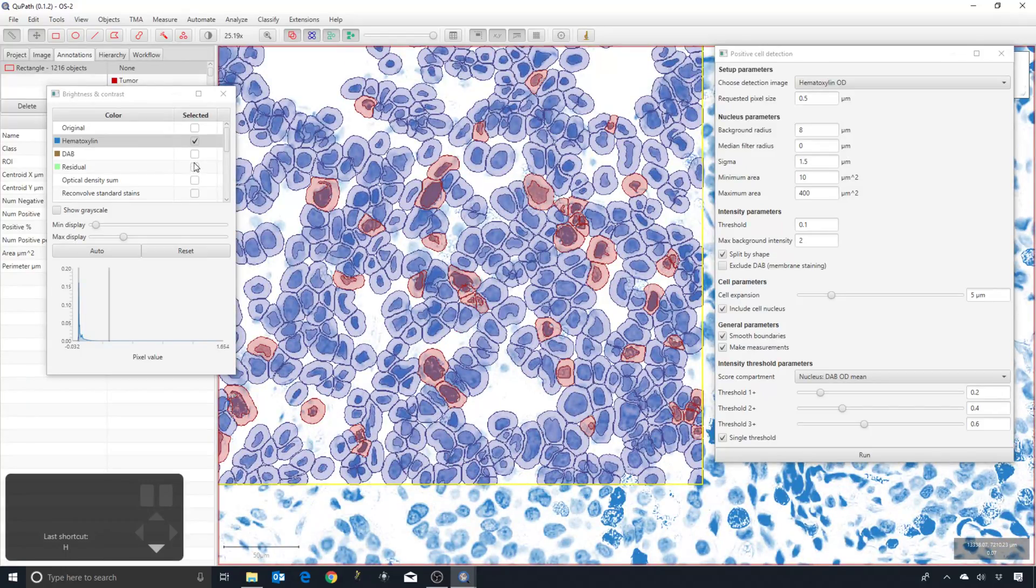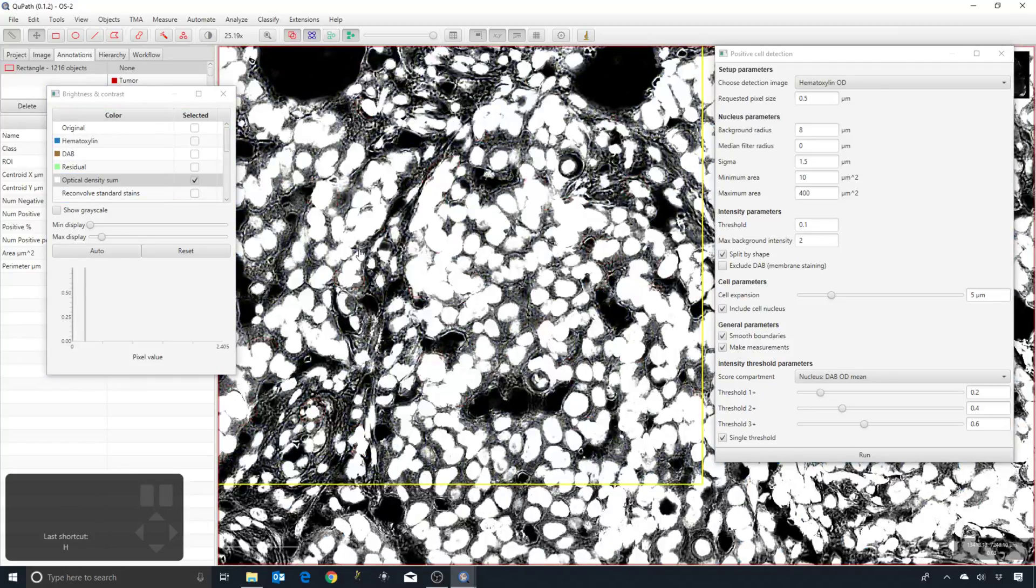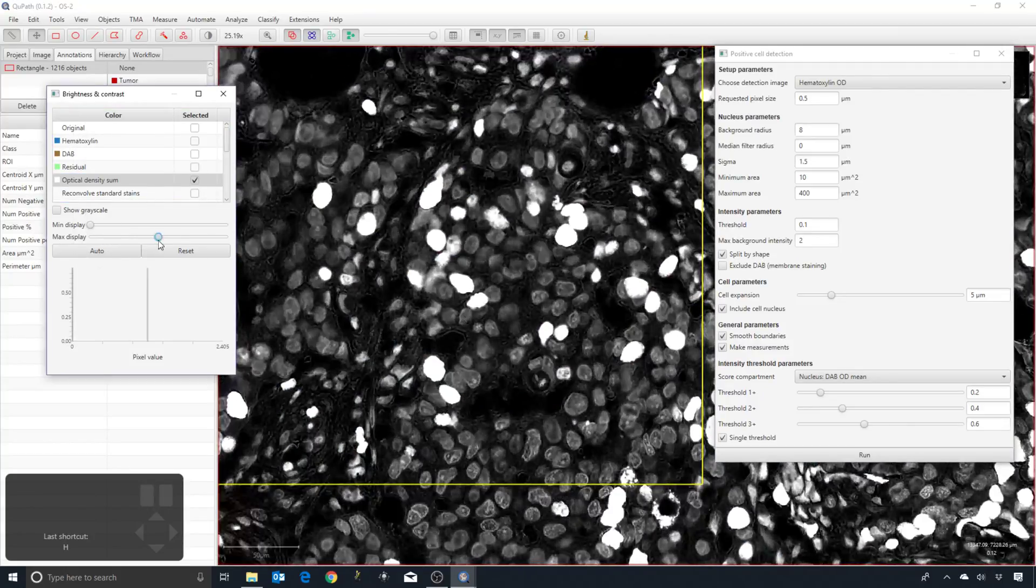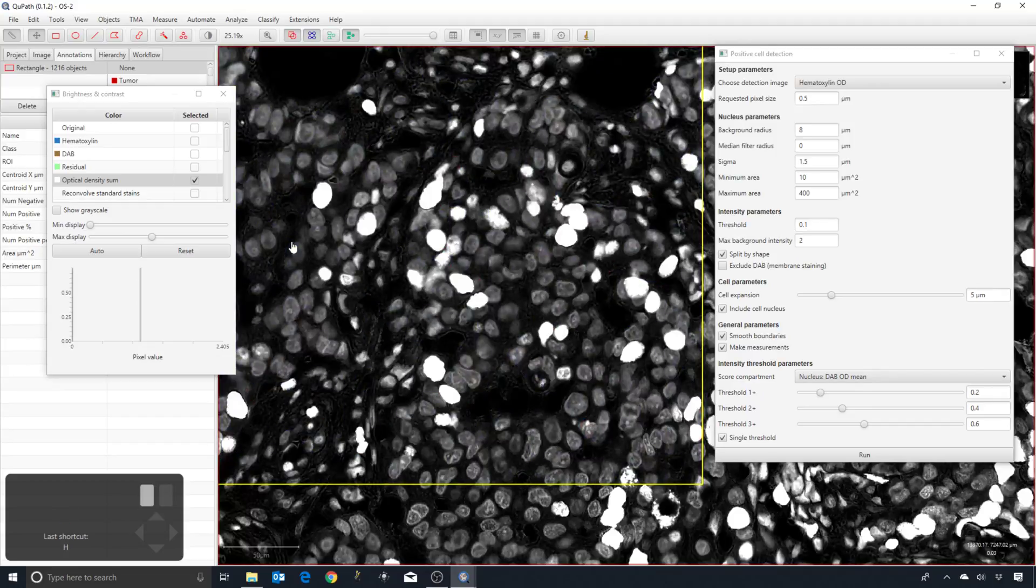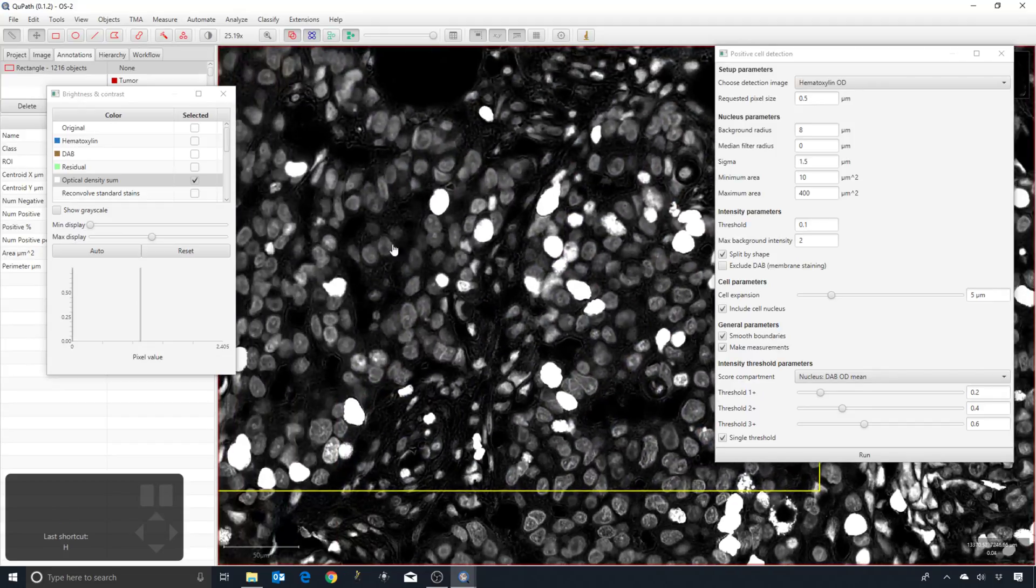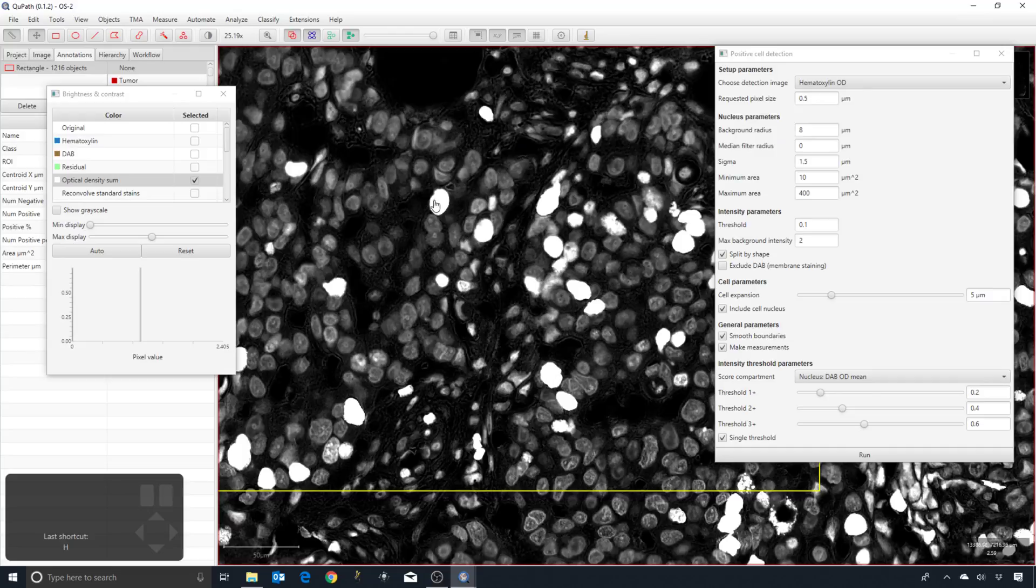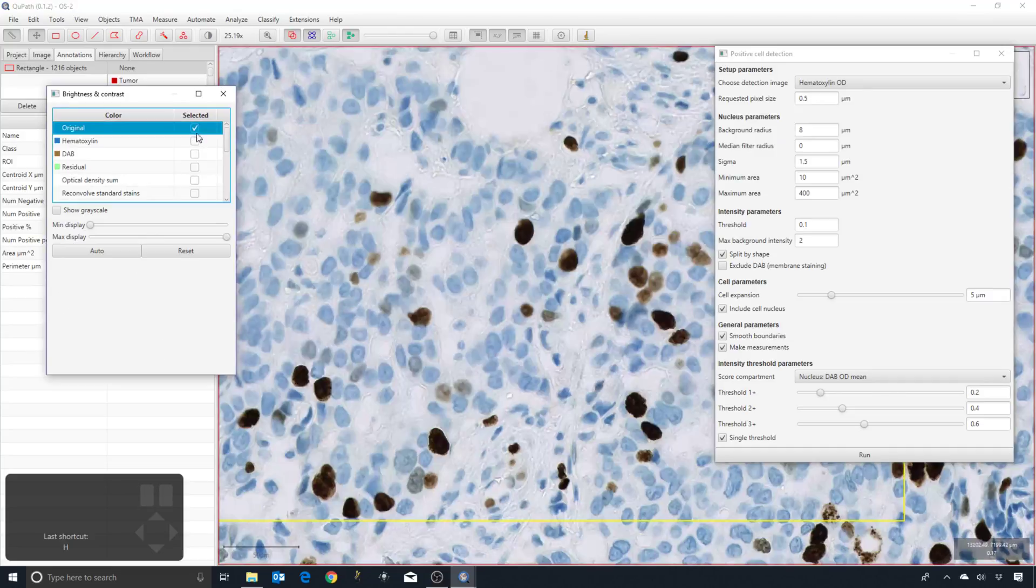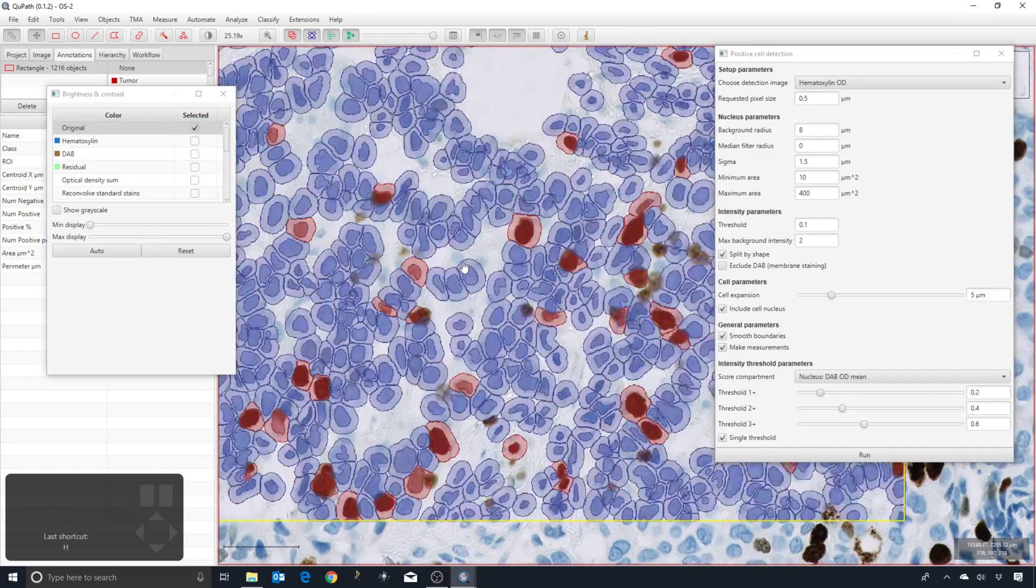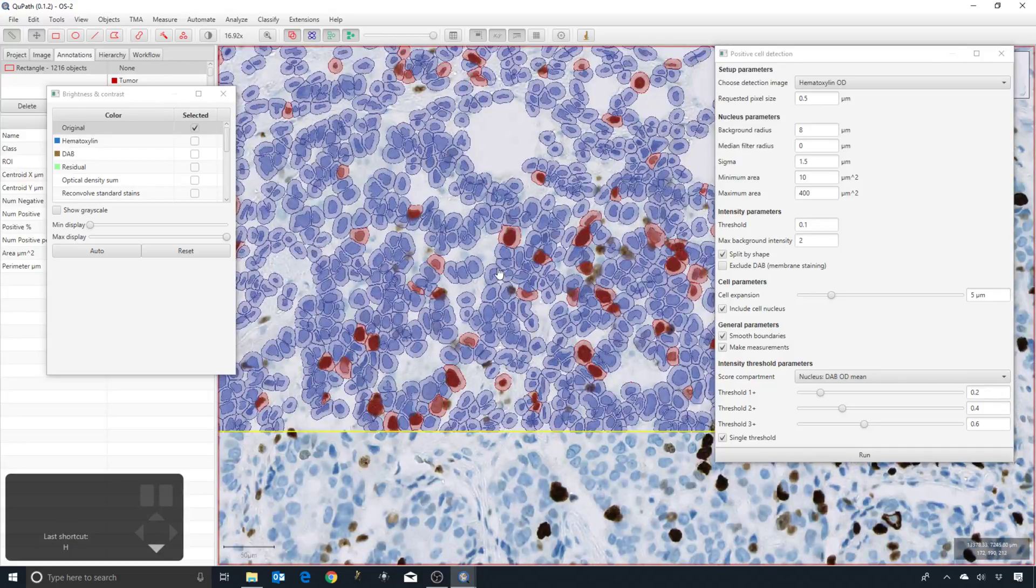The alternative is optical density sum, which is really just using all the brightness information regardless of what the stain color is. You can see that now we have much higher values in the positive nuclei and we still have fairly high values in the negative nuclei as well. That would then suggest to me that it's worthwhile changing this optical density sum.